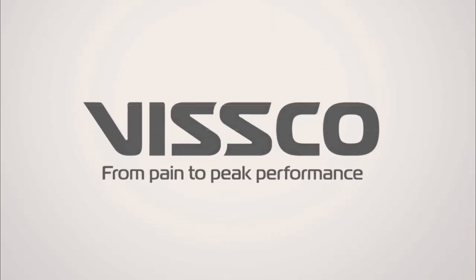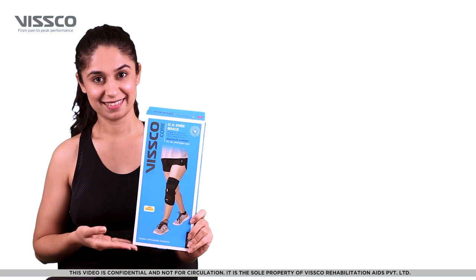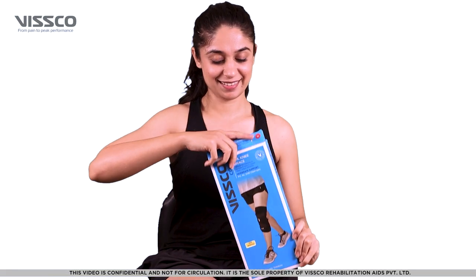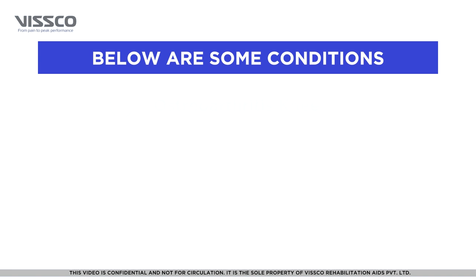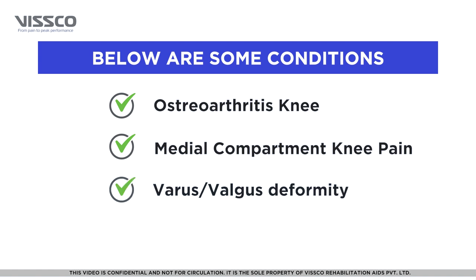Hi there! Greetings from VSCO! Let us now see how to wear the VSCO OANE brace, product code 438. The VSCO OANE brace offloads the pressure on the knee and prevents varus or valgus deformity. It is used in cases of osteoarthritis of the knee, medial compartment knee pain, and varus or valgus deformity.